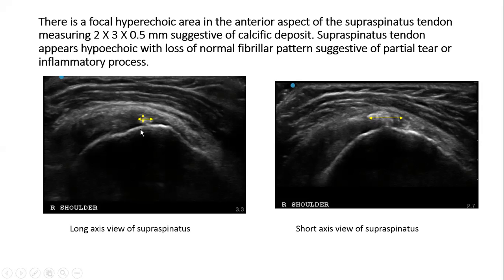This is the distal part of the supraspinatus, the most distal part visible, because then the supraspinatus tendon inserts here. You cannot go more distal than that. Proximal would be somewhere up here, if you're talking about tendon or muscle.